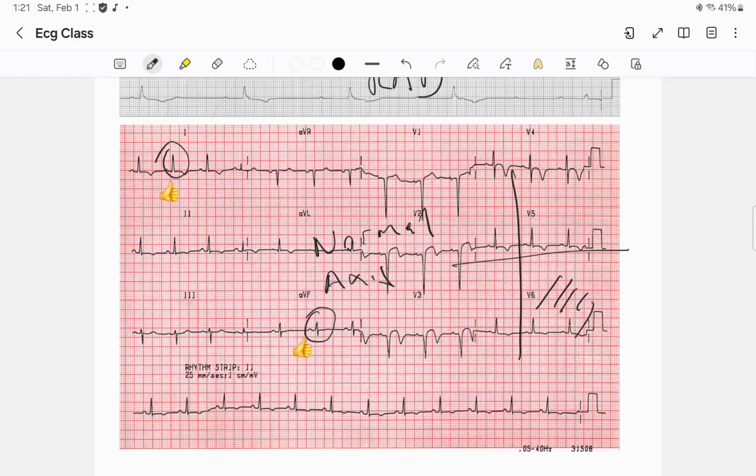Okay, so I hope this was very helpful. I know that generally speaking, persons tend to have a little trouble with axis interpretation. So I hope that this way of breaking it down made it easy and straightforward for you.